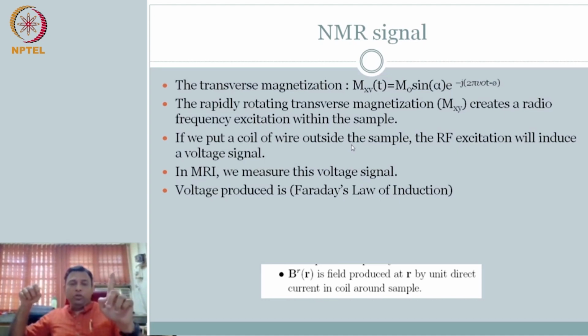So if we can do the forward, then I can say, if I have a magnetic field and I put a coil, this will be the voltage or the current that is coming. So I can characterize this. I can have this BR, which is my receive coil. In some sense, it's calibrated. So receive coil sensitivity. Okay.